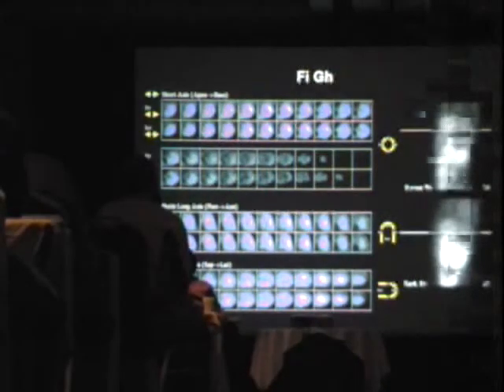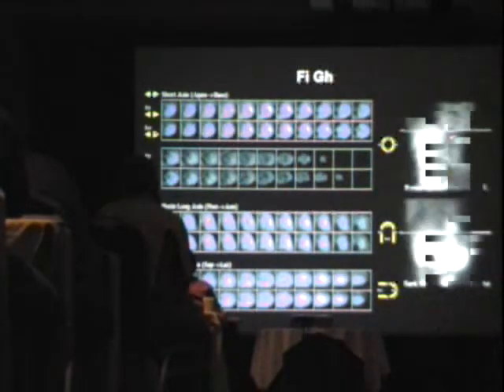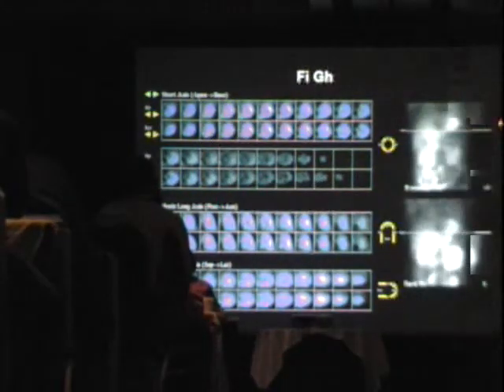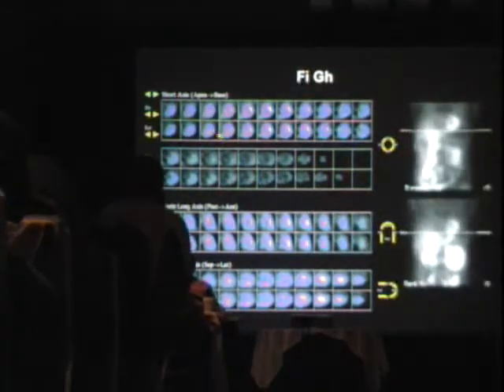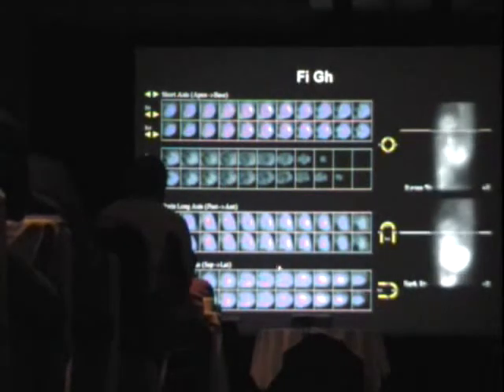This is a female patient, and in fact, they're trying to identify where the breast shadow is in relation to the heart. And here it's not self-evident, but this is something you definitely need to look for on the images. There's a very modest insinuation of the breast shadow here, but you essentially have a defect here in the anteroapical wall, which appears to be fixed, right? And this is evident here. The appearance of breast artifact is very important. They typically spare the apex of the heart. It stays within the mid to apical anterior wall, spares the septum.